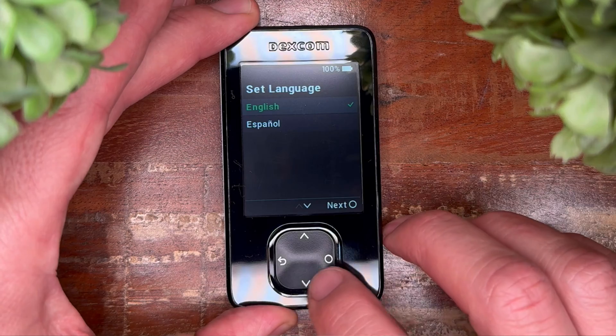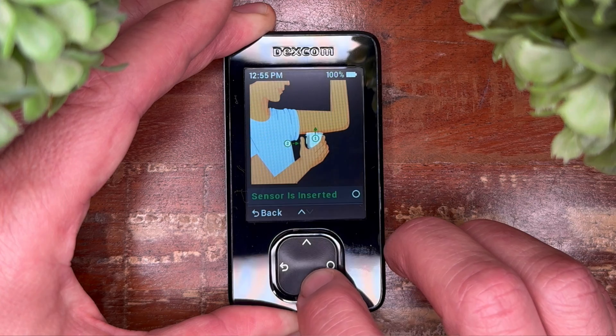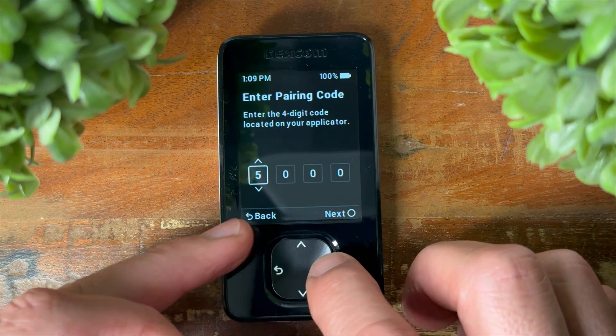Step one — a brief overview. If you have the starter kit and intend to use the receiver device, know that this is a Bluetooth-only device. Though it will speak to your sensor to receive your glucose readings, it is unable to share this information with your family members or your endocrinologist unless you take it to your next visit where they can plug it into a computer. For that reason, the included receiver will not need any Wi-Fi setup. If that's you, go ahead and pause the video here as you walk through your language, time, date, and disclaimer prompts. When you hit that screen, skip forward and meet back up with us at the application chapter.